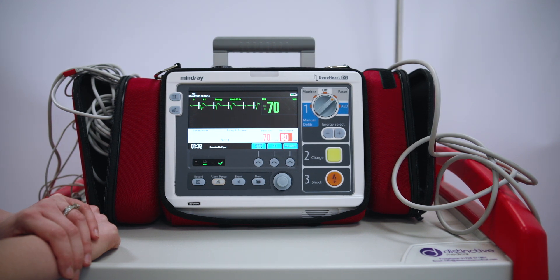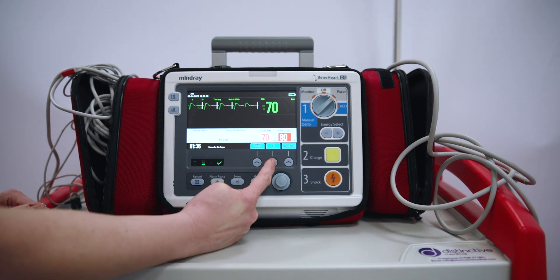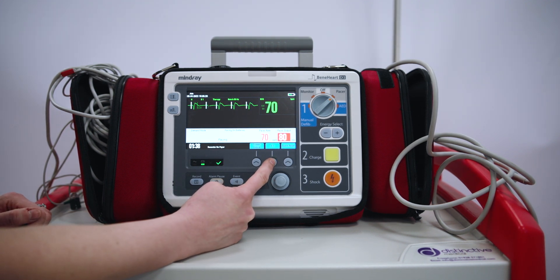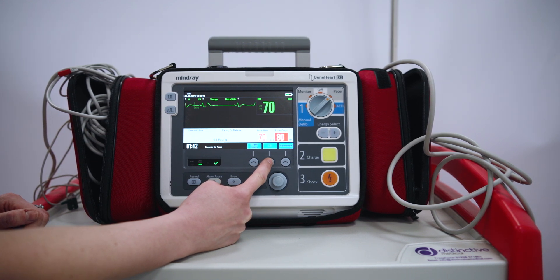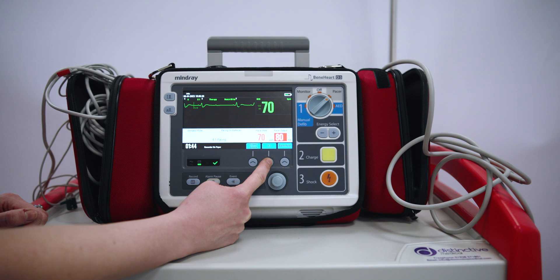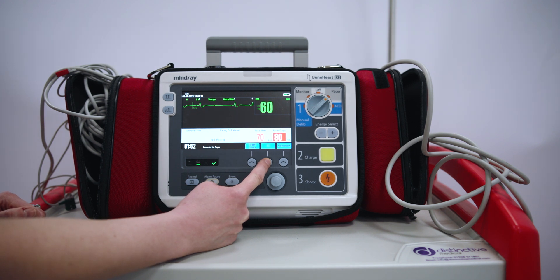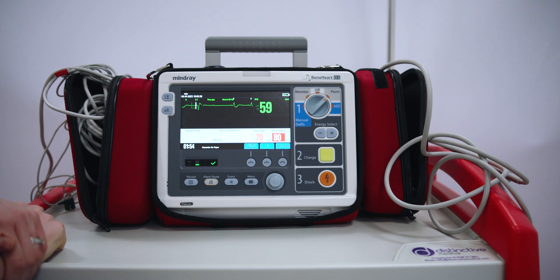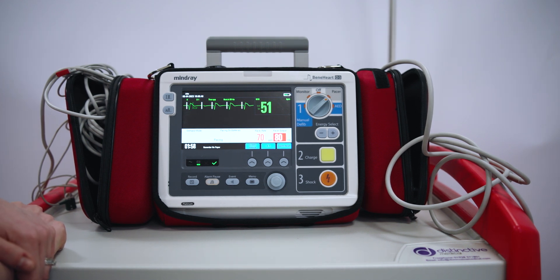When the cardiologist comes and wants to see the underlying rate of the patient, I press the 4 to 1 ratio button and hold it down. This shows a 4 to 1 ratio with pacing spikes so we can see the underlying rhythm without having to take the patient off the pacer. As soon as I let go, the pacing automatically goes back in, and we can safely transfer the patient out of the department if needed.